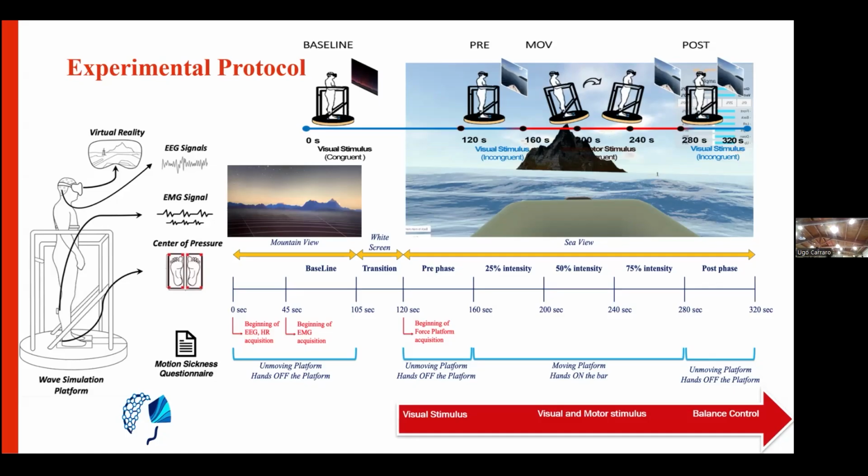Right, that's the baseline. But then we give them a static visual stimulus. So nothing is happening except they have open eyes and they look at these scenarios. Then we start the simulation, and they begin by looking at an environment that moves, but nothing else is moving. So the platform is not moving.